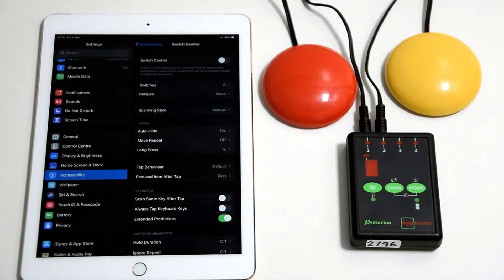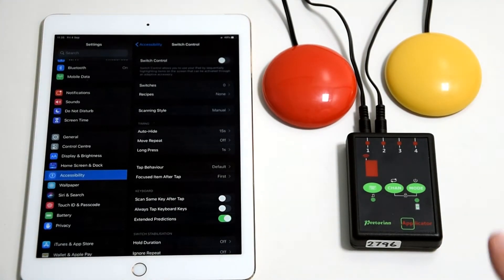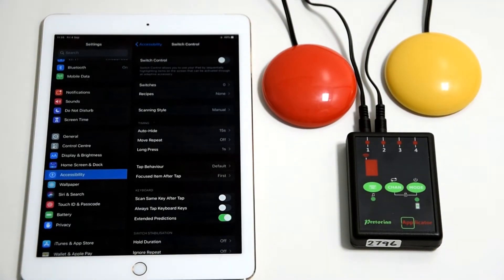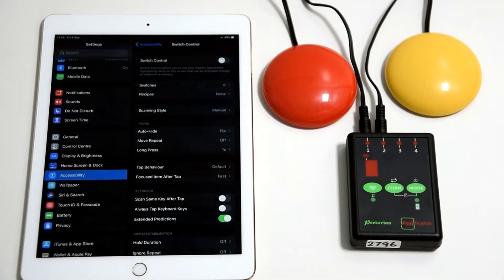Now we're set up with our switches plugged in and set in the correct mode, so we now need to give actions to our switches.